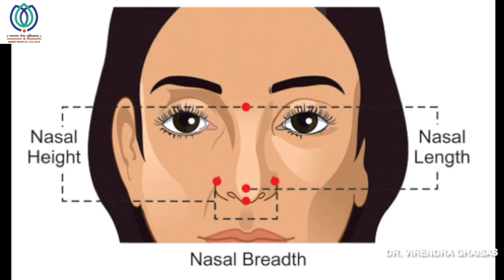Basically, you should keep these variations in mind when you are operating on noses, according to the ethnicity, what exactly the patient's demands are, and what that ethnicity is all about.